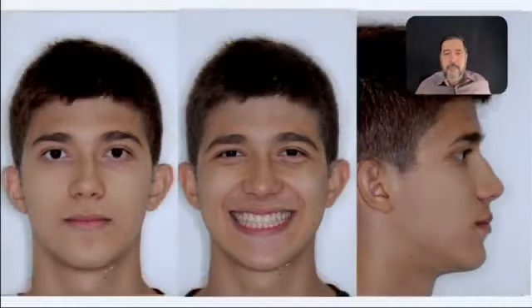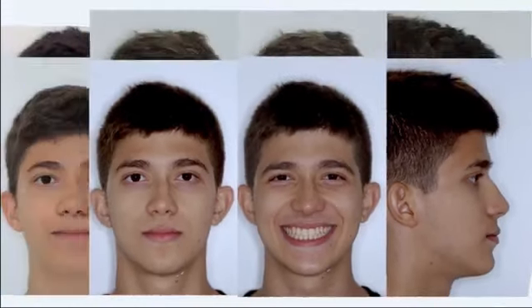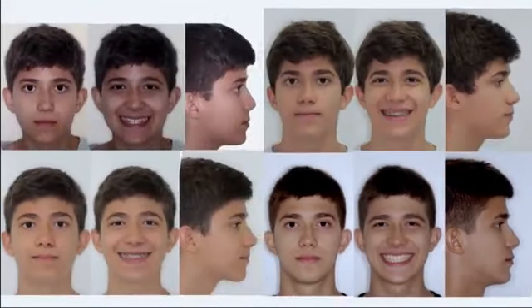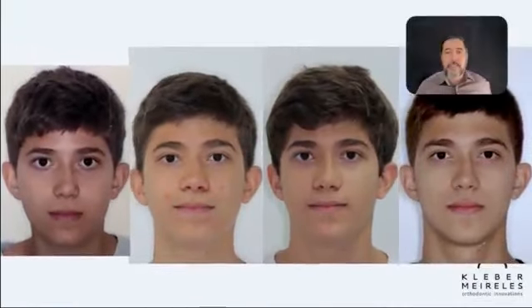And then we have the end of the treatment. After some time after debonding, I didn't find the final photos of this patient. Probably I didn't take them. And here we have the comparison before, during, and after treatment. We see what's going on here.